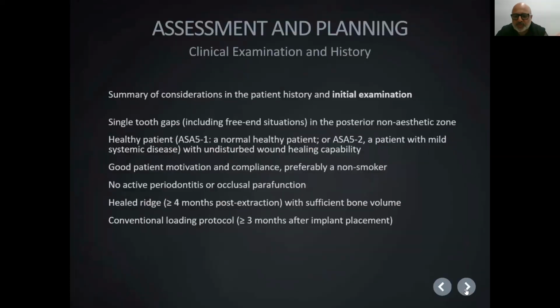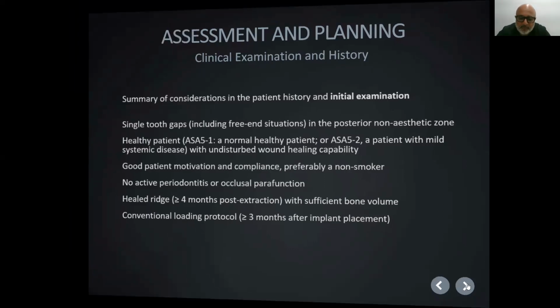Okay, and then your summary of considerations. For initial exams: single tooth gaps, healthy patient, good patient motivation, compliance, no active periodontitis, healed ridge, conventional loading protocol of greater than 3 months.